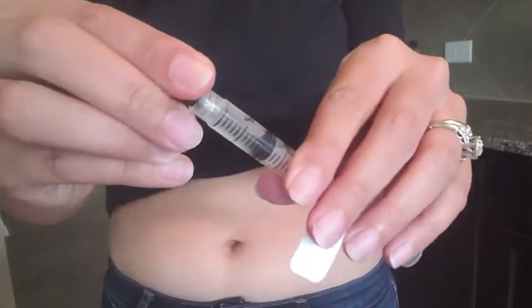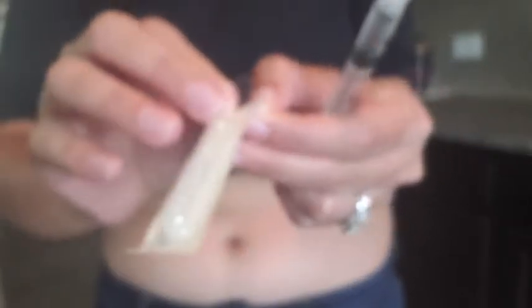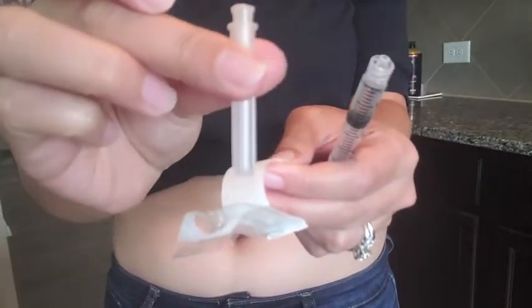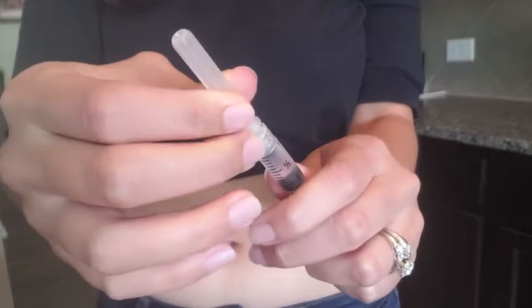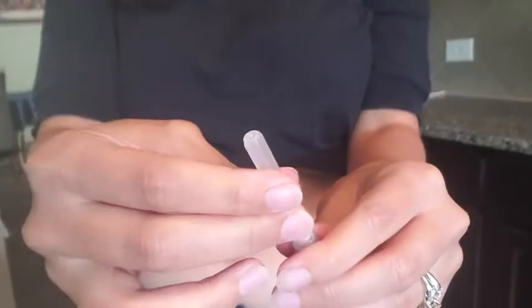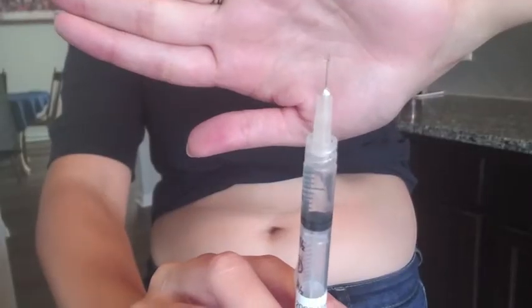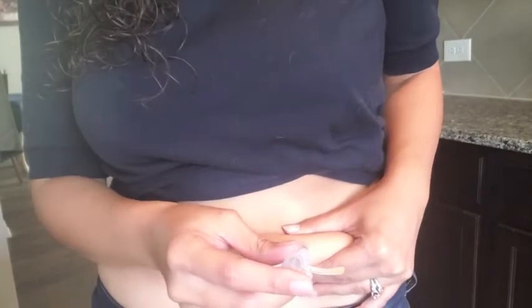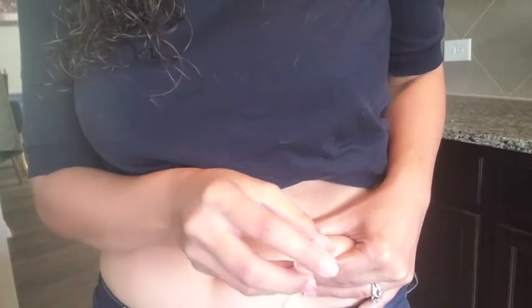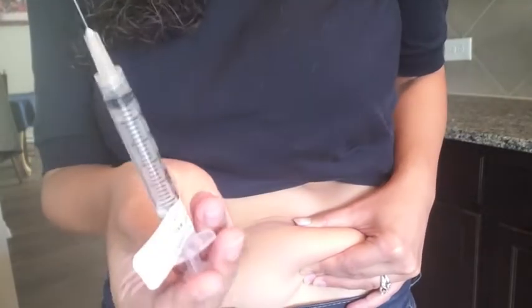With the actual medication, pull off the little stopper and attach the needle, screwing it on to make sure it's good and tight — a nurse would do this much faster. Pull off the little cap and there you have the needle. You also want to prime it: push out the tiniest bit of fluid so you don't inject air into your body. Then pinch your fat — it's good to have some fat in this instance — and give yourself the shot.